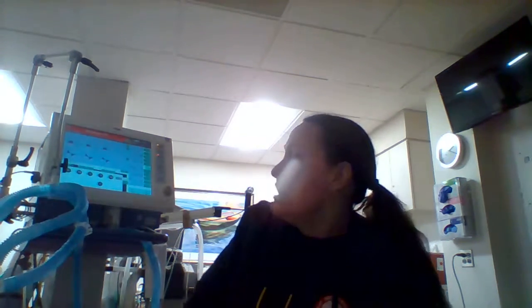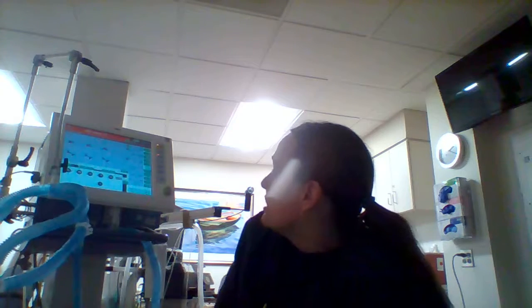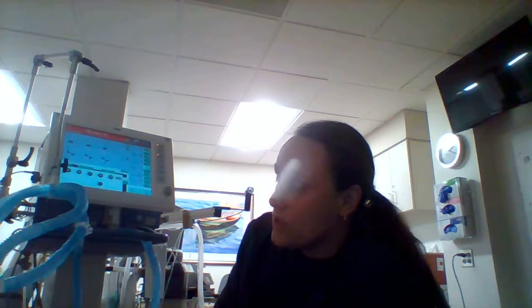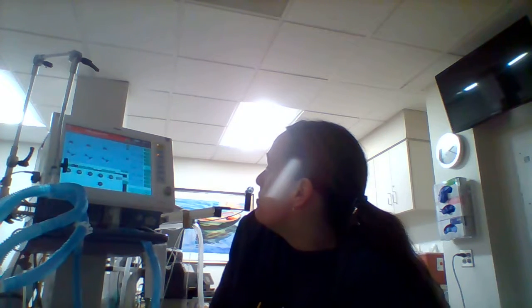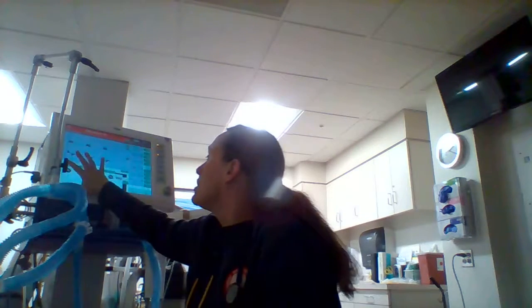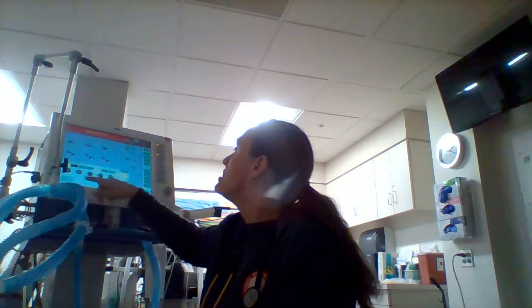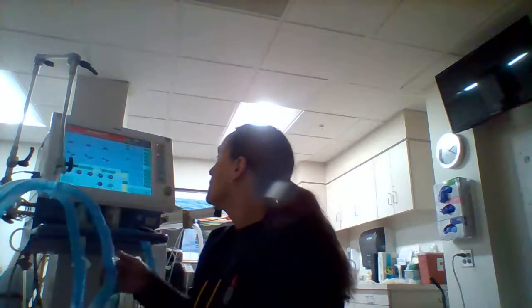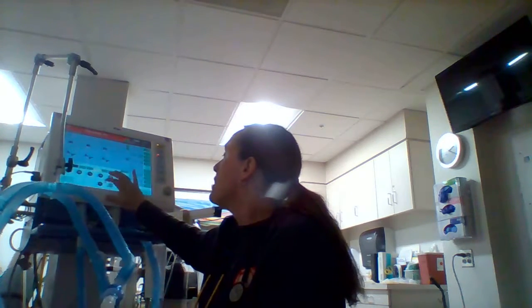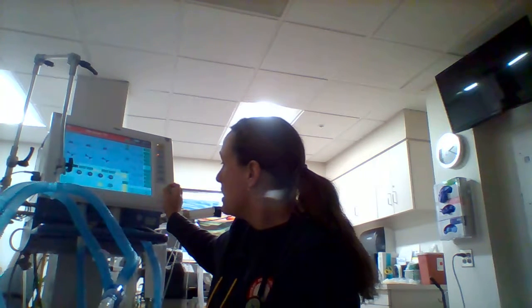Okay, that's cool. And you just want to document all the high alarms, all the low alarms, all the settings, what they're actually doing, if they're on a support mode as opposed to a control mode. Let's say he starts to do better. I'm going to change it to SIMV. Nothing else changed, which is super helpful. Oh, and I can add some PEEP now because he's been here a little bit, been in the bed.